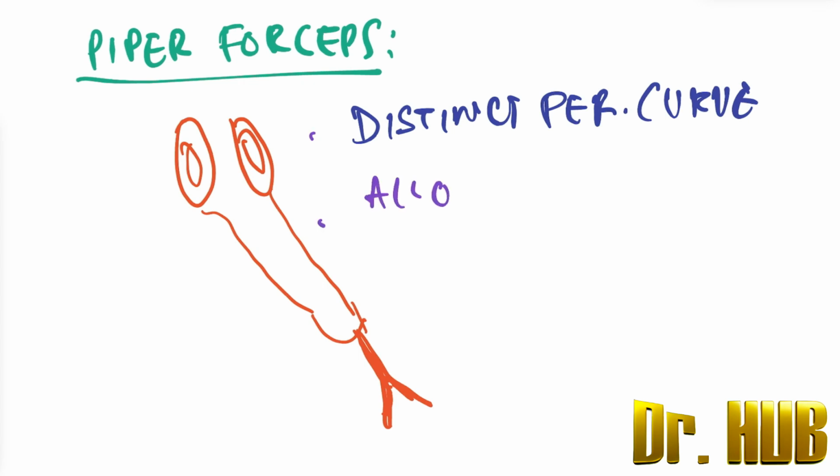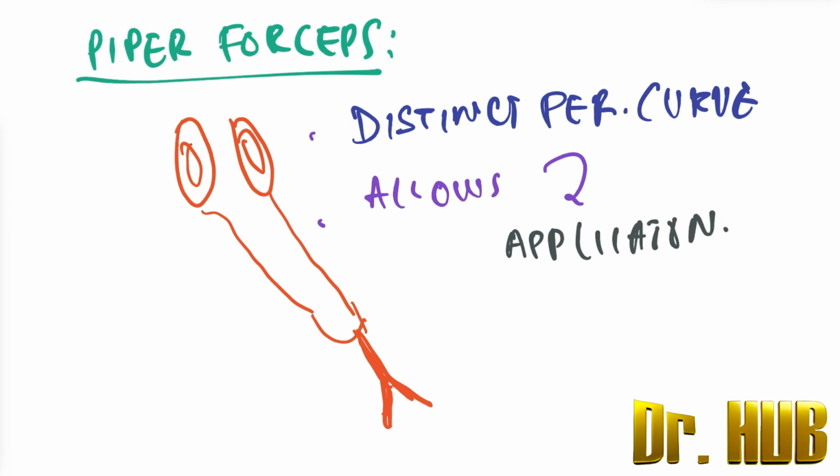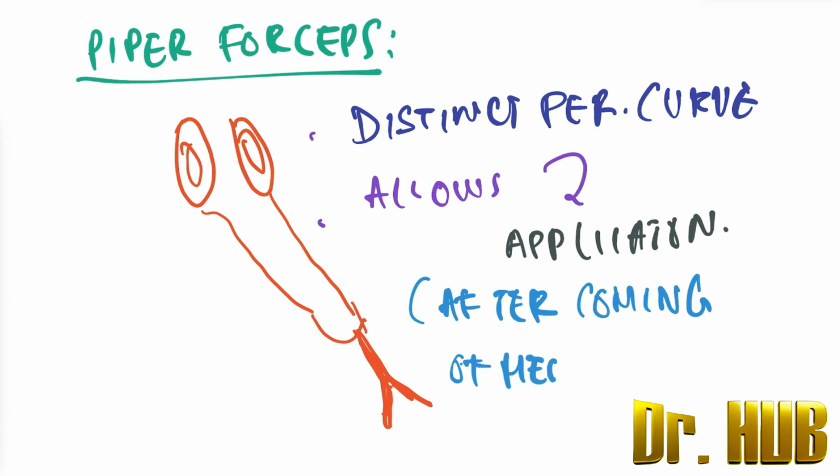So it allows for the application to the after-coming head, and this is in terms of the breech delivery.